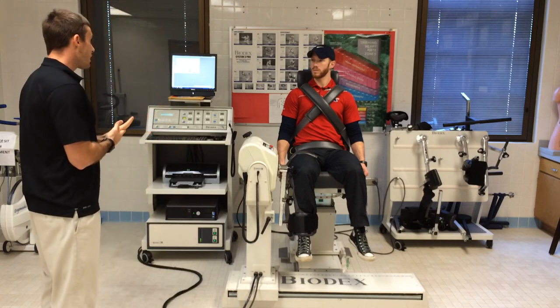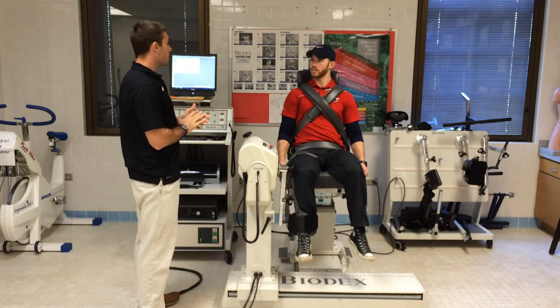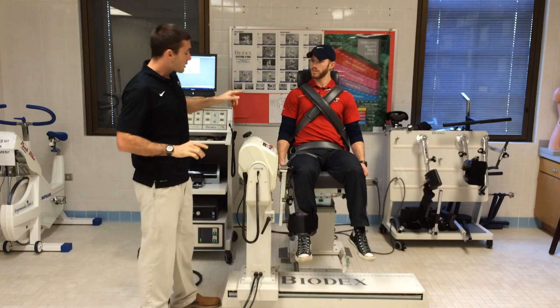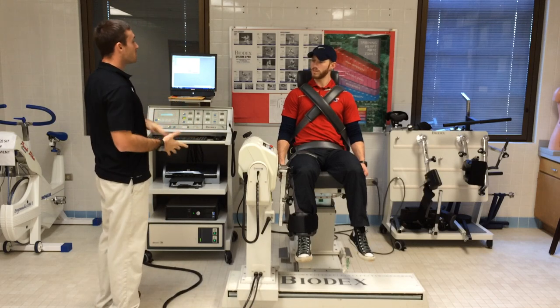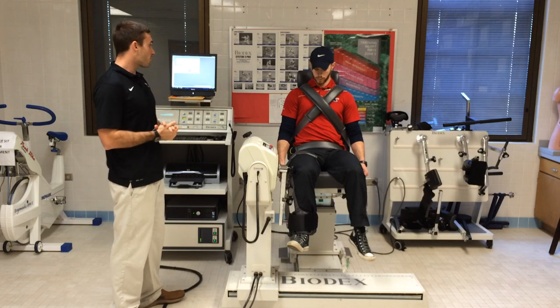So Bo, what we're going to do today, we're going to do a 50 repetition test. So when you'll hear on the screen, it'll give you kind of a buzz or a go. When you hear that, you're going to be kicking your leg out as in and out as fast as you can 50 times. We'll be giving you encouragement, we'll be kind of cheering you on. You just give us the best effort you can on every rep, okay?